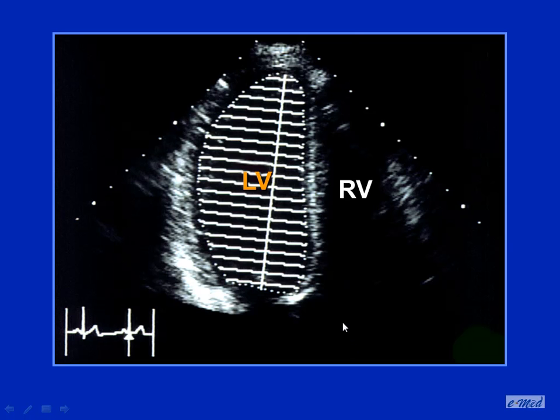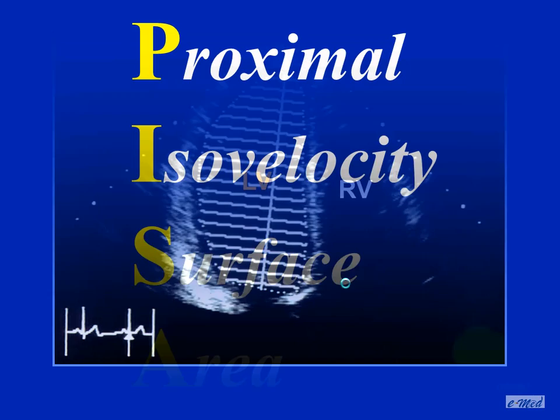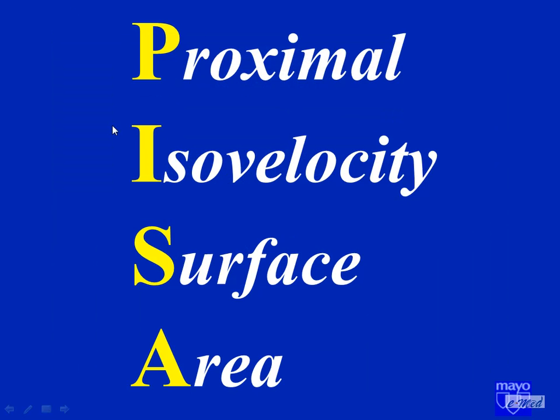That ventricular volume sounds easy. It's kind of difficult. But there are new methods that are very interesting of detecting the ventricular border by speckle tracking. And I promise you that soon we will have automated methods to measure ventricular volumes in a reproducible way in humans. And so that will make that method usable.